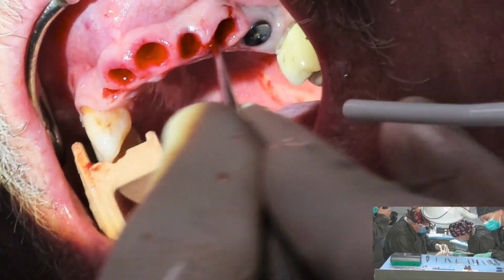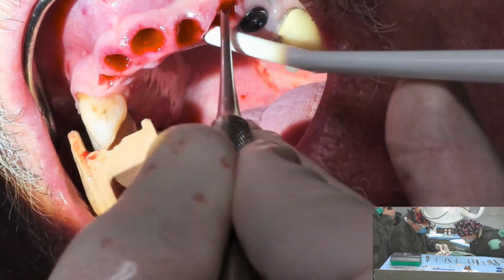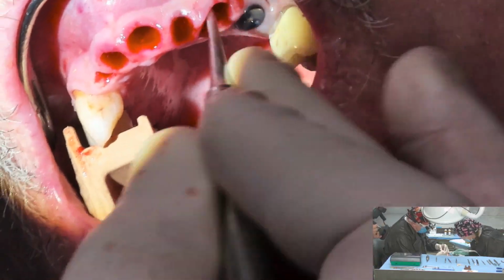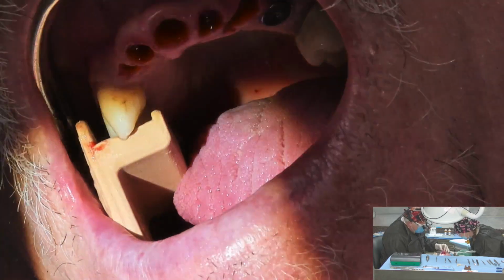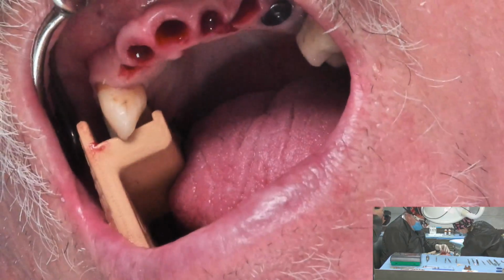And Nicole, if you can, just for the camera, can you run and get me the big mirror? Because we're going to be doing some occlusal shots here. I think that's probably better. All right. So now we've got debridement. You can see hemostasis is really good. So at this point, we're going to start our site preparation. Okay.